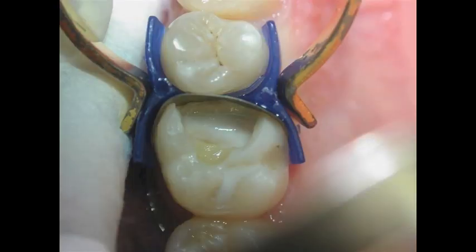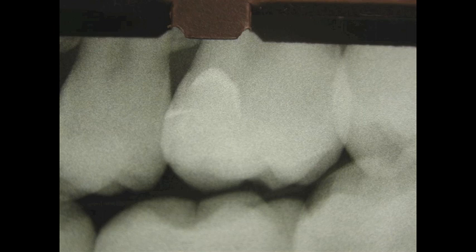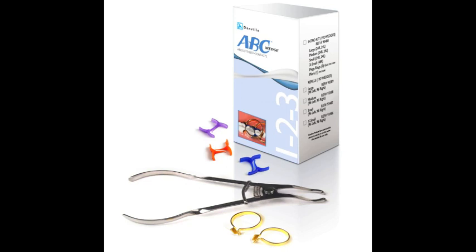The ABC wedge can be used with any of the currently available separating ring systems. Since the tooth is not flat or square, the ABC wedge is a viable option to seal off the gingival margins, and at the same time it prevents distortion of the matrix band from being crushed inside the box.